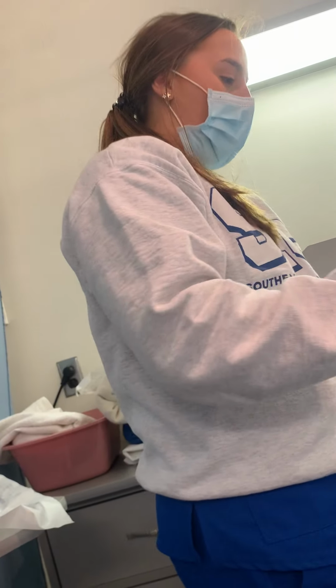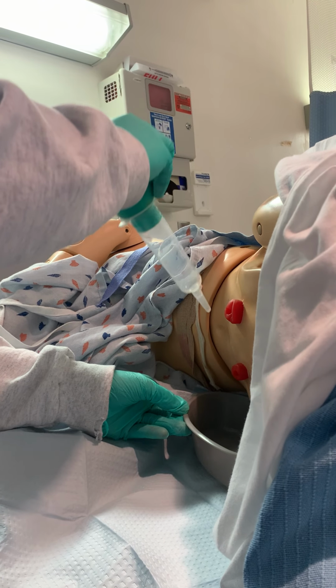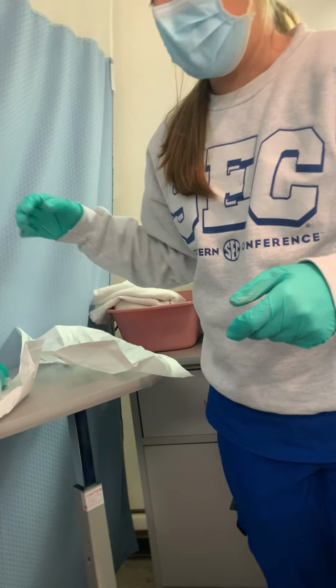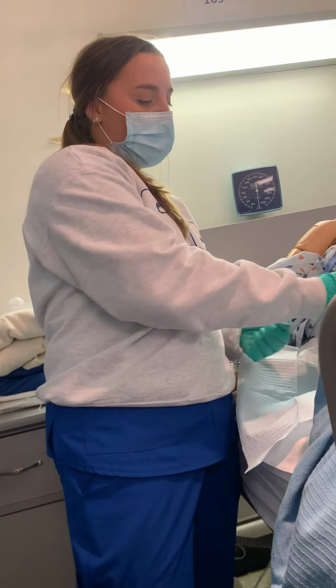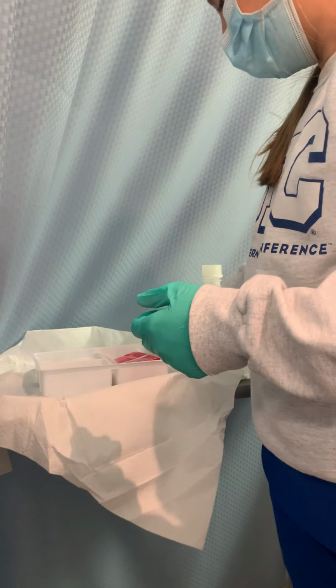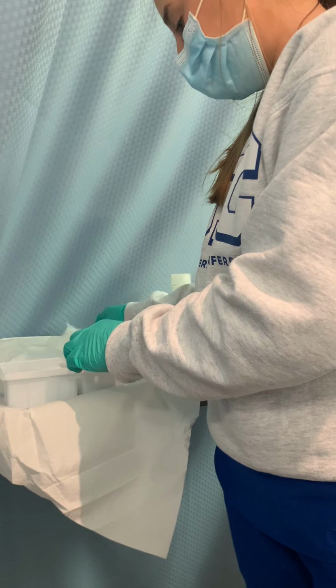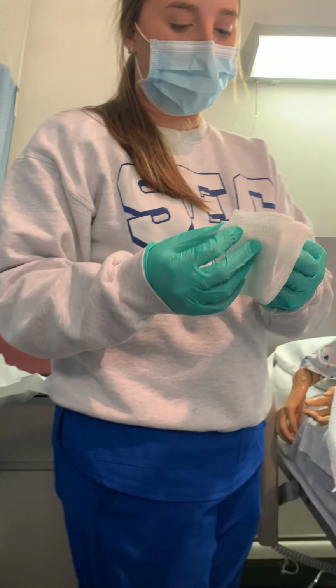So now I am going to get some of my solution out and pour it over the wound. Okay. And now I don't see that the doctor has packed anything in, but if it were packed, I would go hand over hand to get the packing out. So now I'm just going to pat my wound dry.